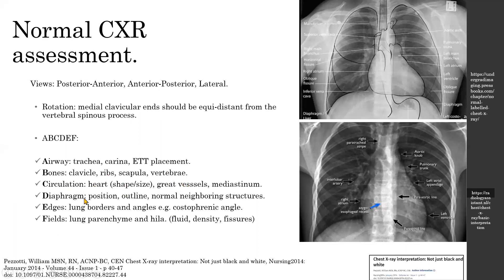D stands for diaphragm, where you assess its position — whether elevated, depressed, or normal — as well as its outline and neighboring structures. E stands for edges, where you assess lung borders and angles such as the costophrenic angle for fluid. F stands for field, where you assess the lung parenchyma and hila for fluid density and assess the fissures.